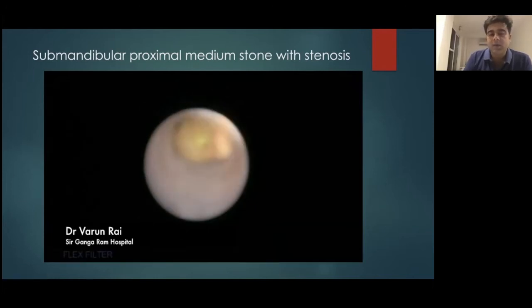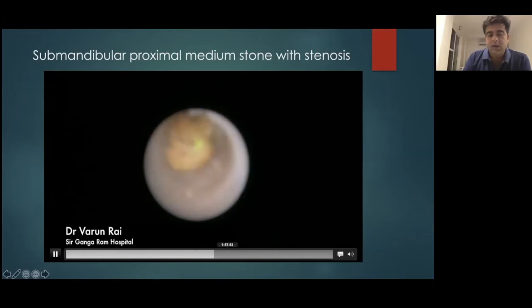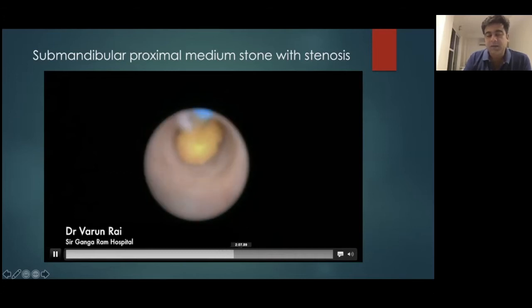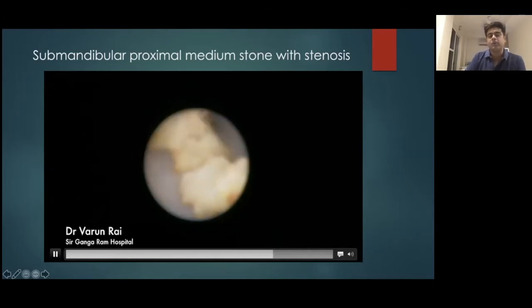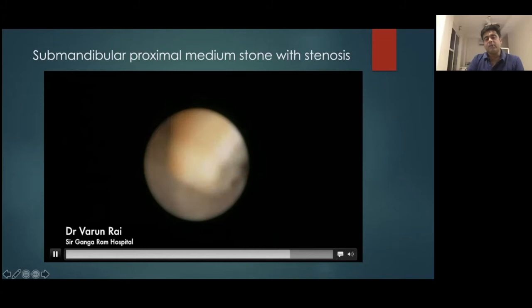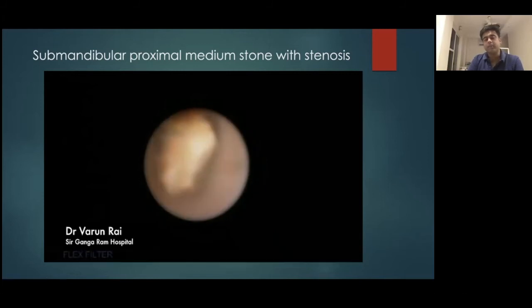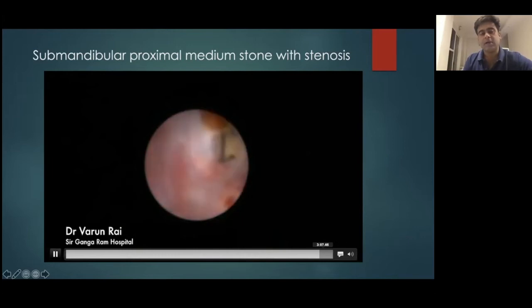We can use the Holmium laser, which is a fragmentation tool where we break the stone into smaller fragments. The idea is to fragment the stone into pieces smaller than the narrowest part of the duct so you can easily basket them out. After fragmentation, the stone is converted to almost a horseshoe shape, and a few minutes later it's broken down into three fragments, which are then extracted using the basket. At the end of the procedure, you have a nice normal-looking duct with no retained debris, and the last piece just needs a slight tug.